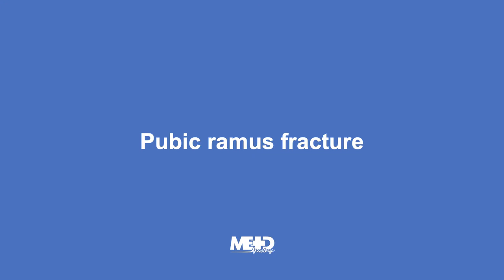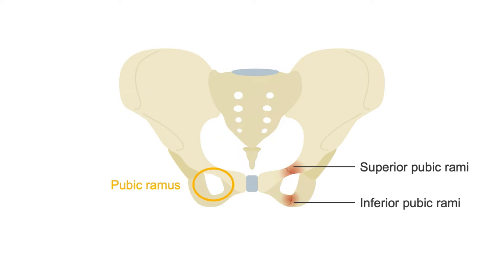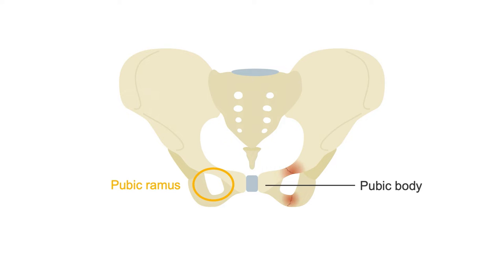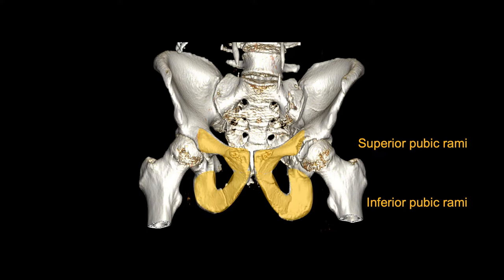Let's look at pubic ramus fractures. A common fracture pattern is a fracture of the pubic ramus involving both small bones of the pubis — the superior and inferior pubic rami. The pubic rami connect in the midline to form the pubic body. Here is a 3D image of the pelvis in this patient who has fractured both the left and right sides of the pelvis. Remember that this ring will fracture in two places, and look for injuries in both the superior and inferior pubic rami in the axial images.